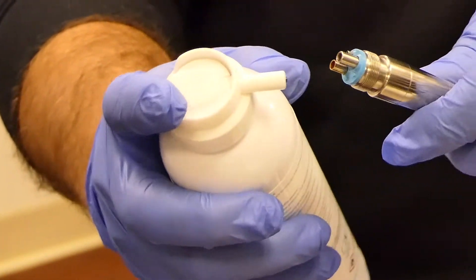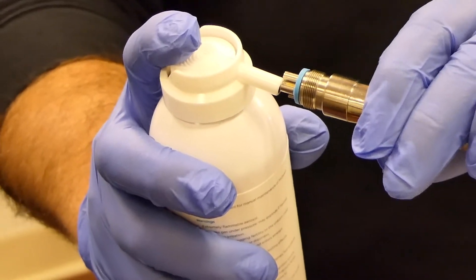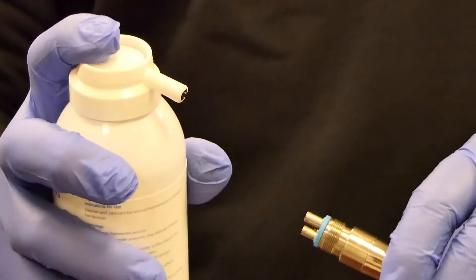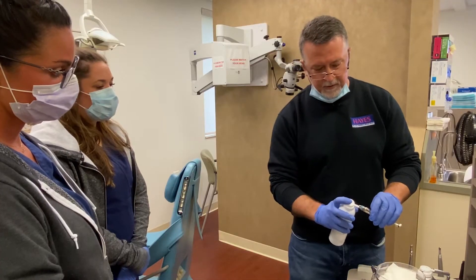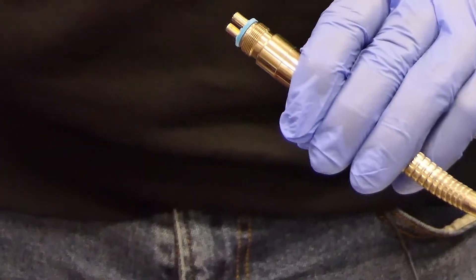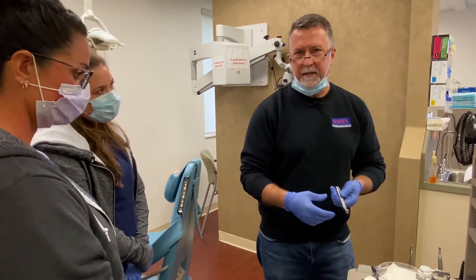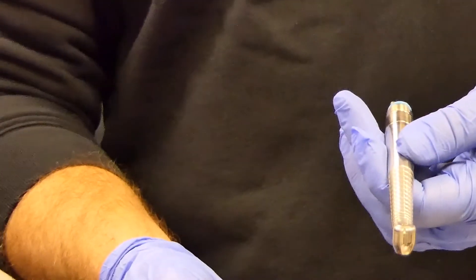To lubricate, we want to use the smaller of the two large holes — that's the air drive going up into the turbine. I'll line the can of lubricant right up with the air drive and, as fast as I can, push down on the cap and lift off. You're going to see lubricant ooze out of the head of the handpiece. Now we need to go ahead and expel that debris and lubricant out of the handpiece.